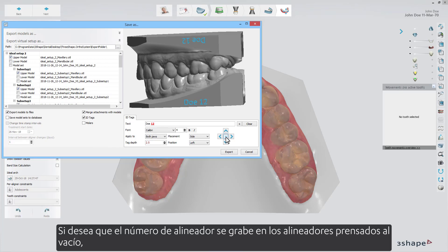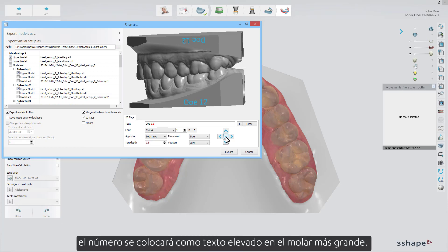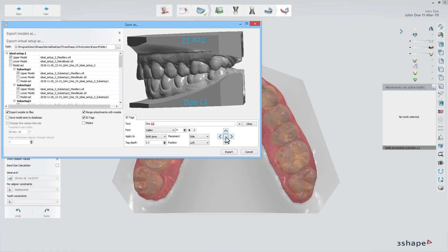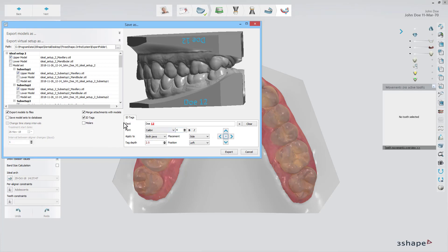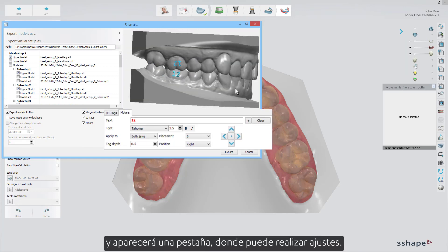If you want the aligner number to be embossed into the vacuum-pressed aligners, the number will be placed as raised text on the biggest molar. To do so, enable the molars option, and a tab where you can make adjustments will appear.